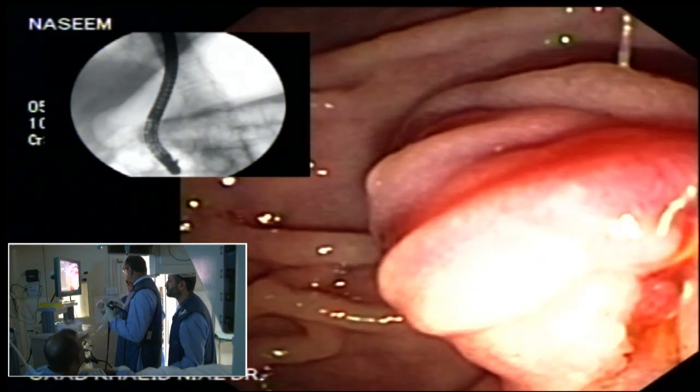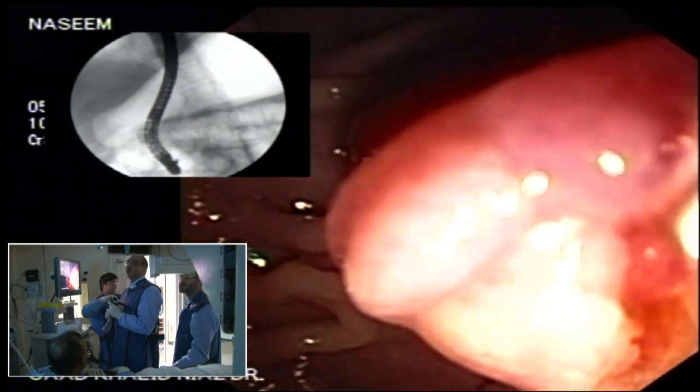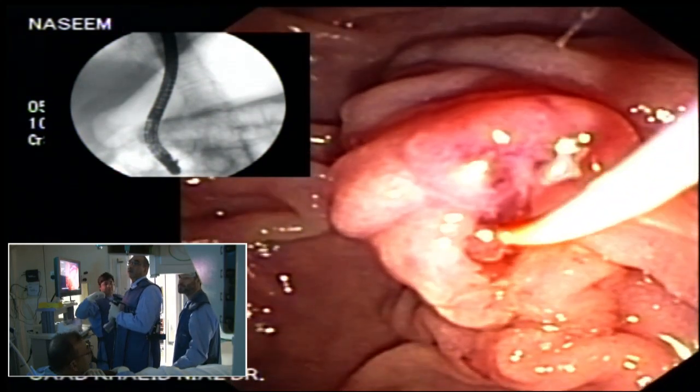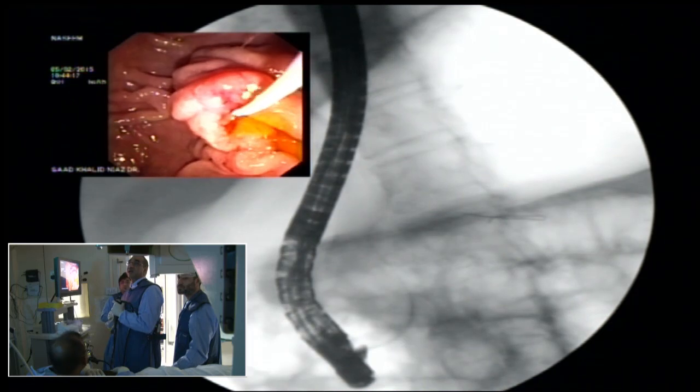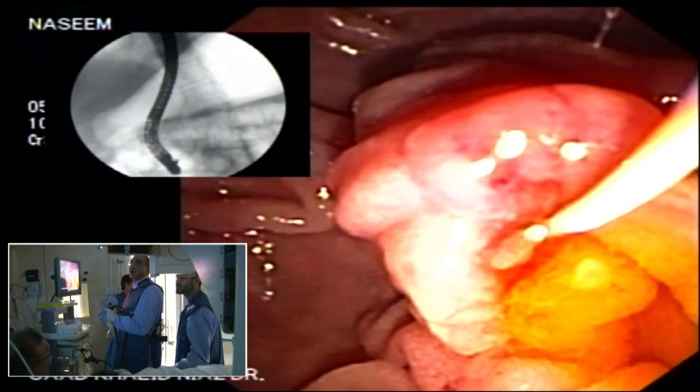वसीम ऐसे करते हैं कि स्टैंड बाद में डाल देंगे, फिलहाल वायर छोड़ देते हैं, डबल वायर पे कर देते हैं. So that is a fairly relevant way to do it. Now you've got a guidance there, and you can see bile coming out as well. So we'll just try and go above that.